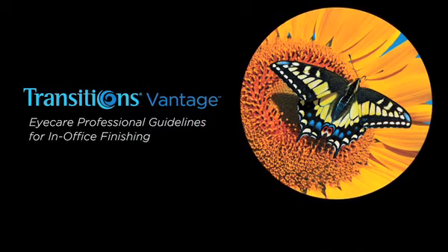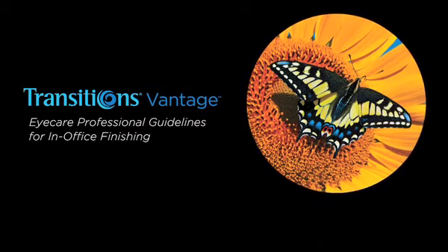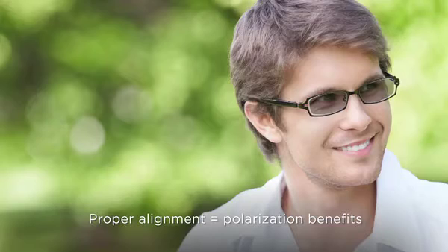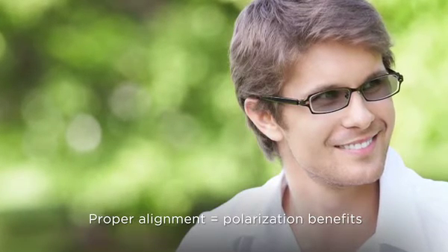If you finish lenses at your office, Transitions Vantage lenses will need to be processed carefully to ensure proper alignment. If aligned incorrectly, the patient will not receive the maximum benefits of variable polarization from their Transitions Vantage lenses.